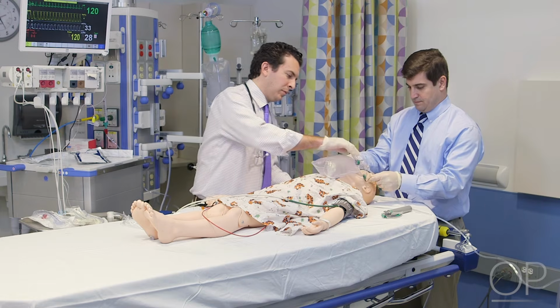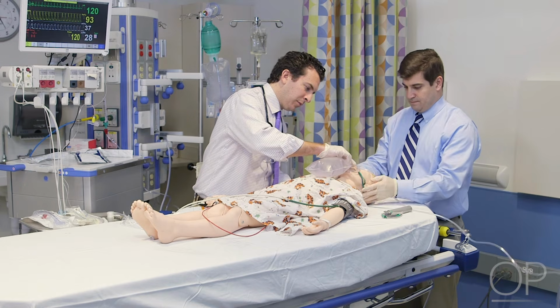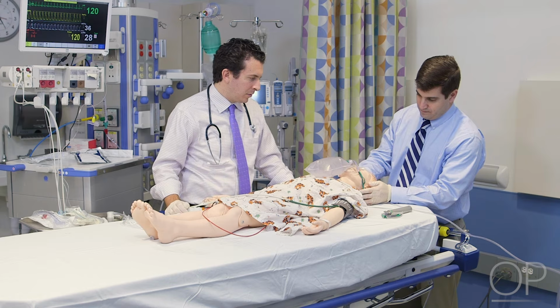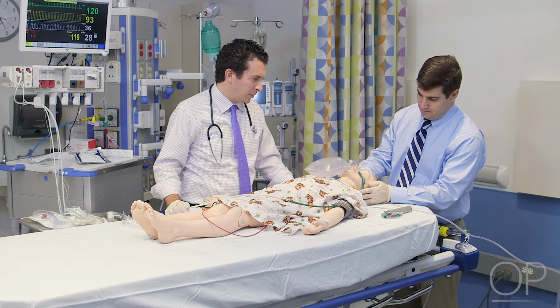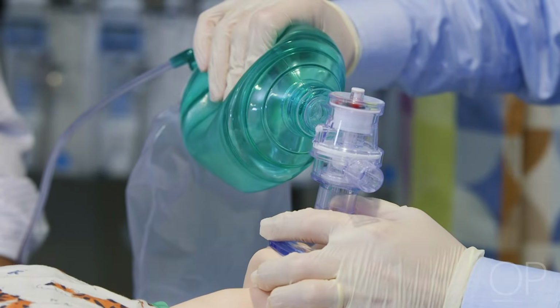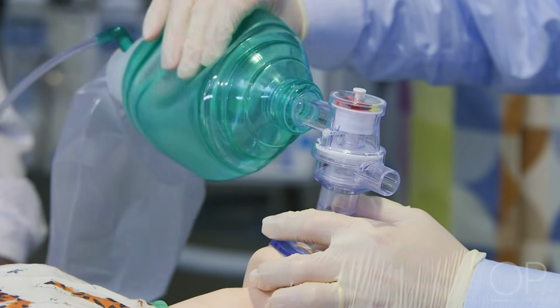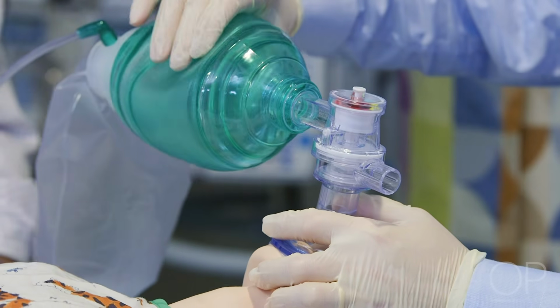Pre-oxygenation should be performed according to the area of practice and patient population. The use of a non-rebreather mask or flow-inflating bag for a minimum of 2 to 3 minutes is commonly used. In patients with inadequate oxygenation or ventilation, gentle, positive pressure breaths using a bag and mask may be required.